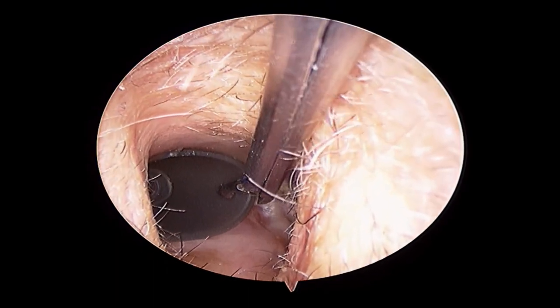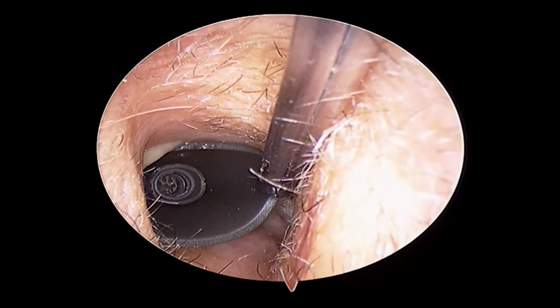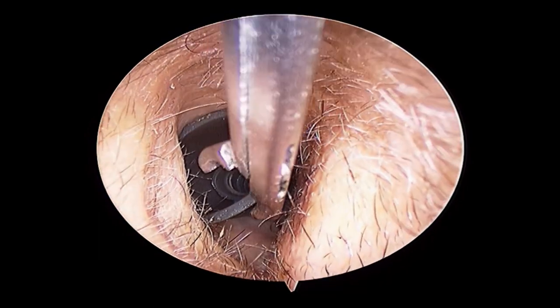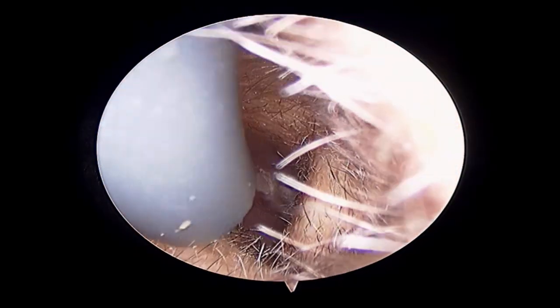He will, with the help of his instruments — especially the cup forceps or crocodile forceps — remove it gently for you. As you can see in this video, he is bringing the dome of the hearing aid out of the mastoid cavity gently.